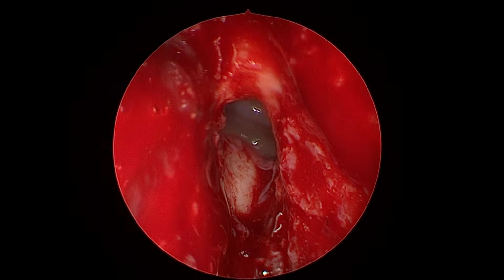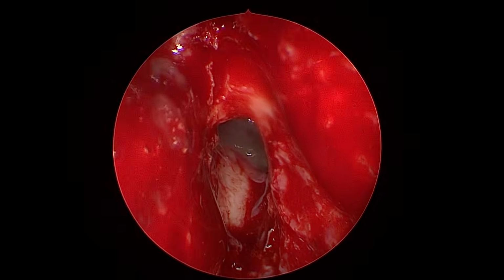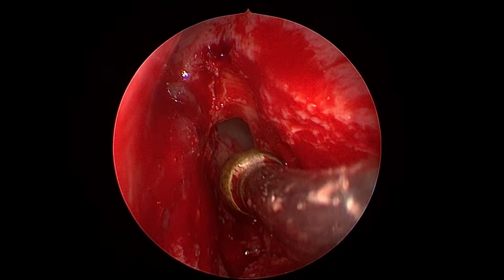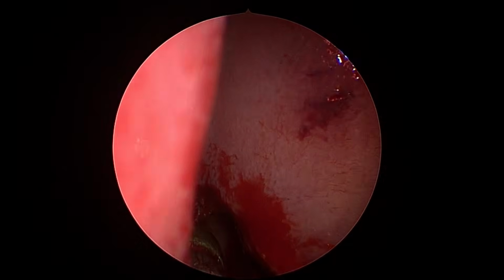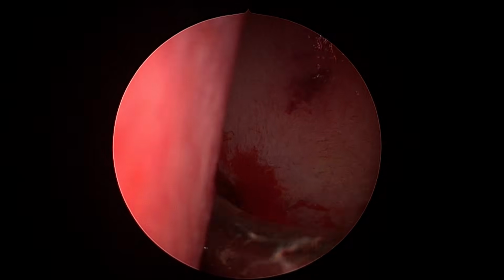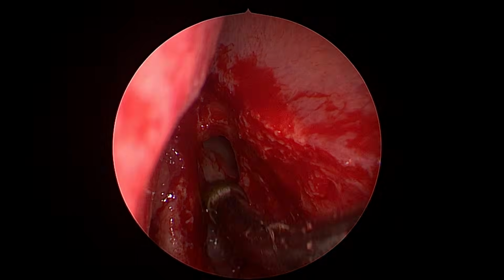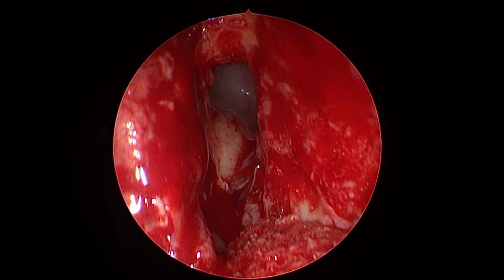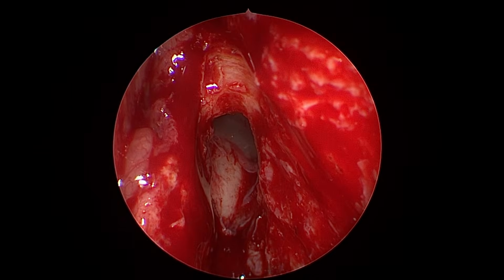Yes, sir. Imagine, had I not opened like this, now see the highway, I would not be so confident in pushing the topical so effectively. Now, this additional 2 minutes of extra punch and drill has made his life amazing. That is what you need to do in frontal. You have to do adequate work. Yes, sir.